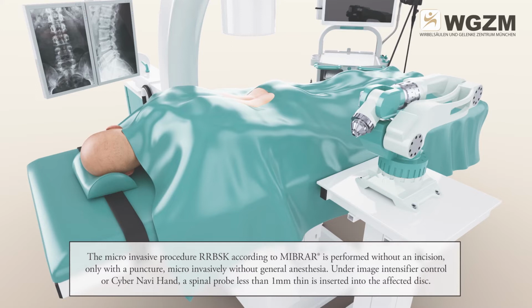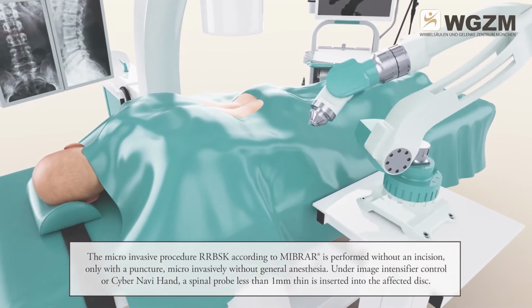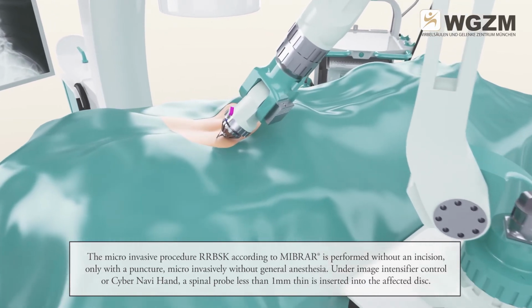The micro-invasive procedure RRBSK according to MIBRAR is performed without an incision, only with a puncture, micro-invasively without general anesthesia. Under image intensifier control or cyber-Navi hand, a spinal probe less than 1 mm thin is inserted into the affected disc.